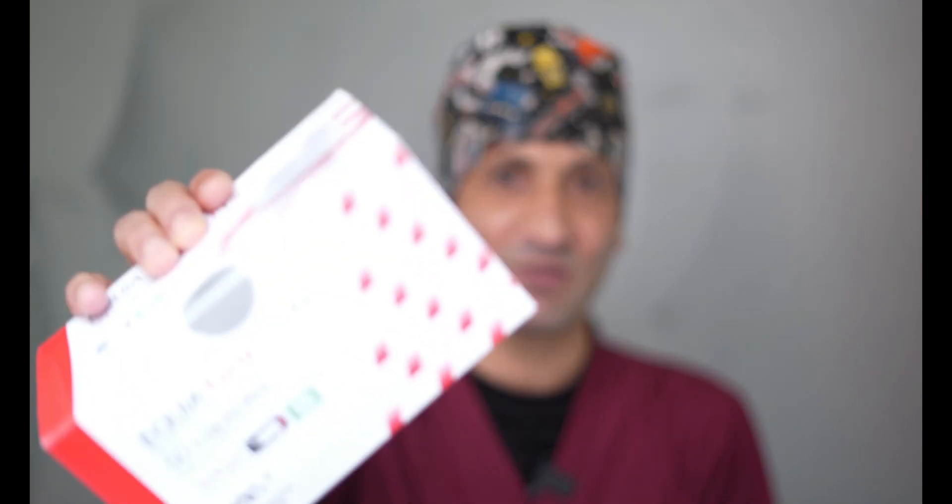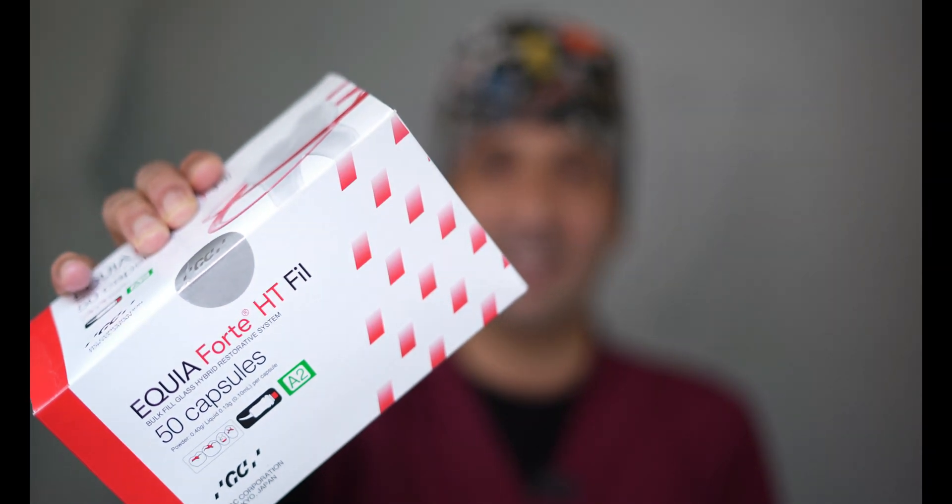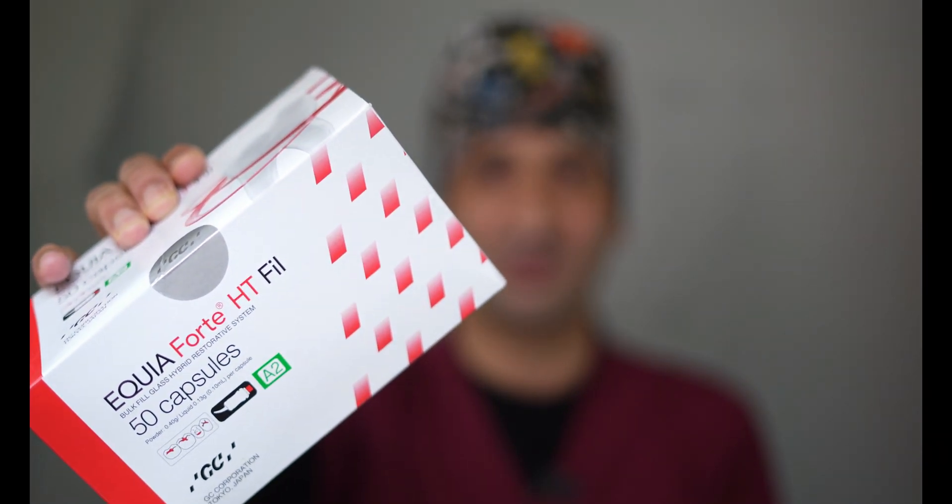Hello all, this is Dr. Roo from Passion Dentistry. Today I will tell you about the EQUIA Forte HT filling and how it is better than any other dental fillings available right now. This video is going to be helpful for all dental students, dental practitioners, and most importantly patients also. Please keep watching the video till the end.